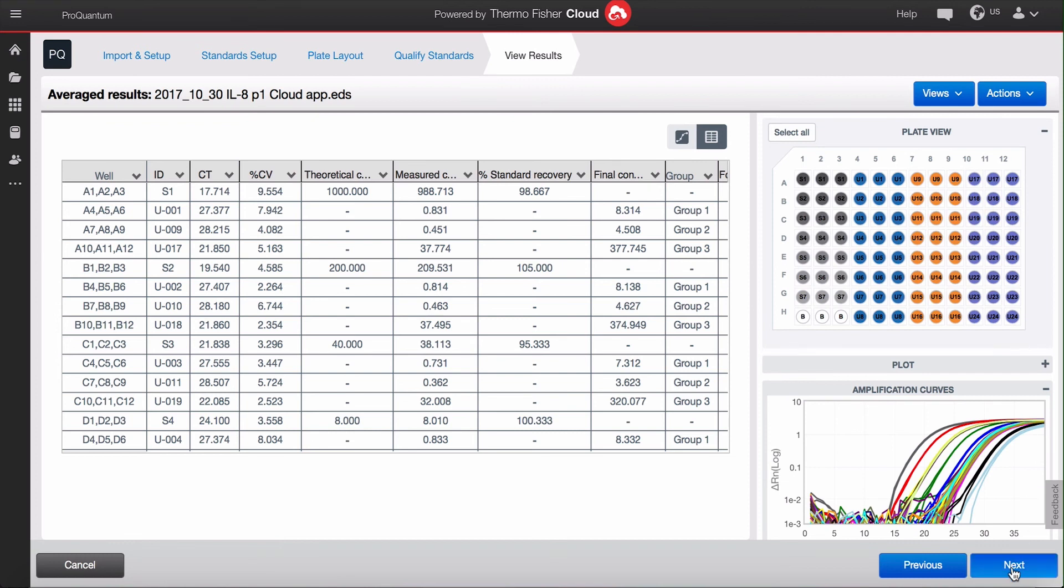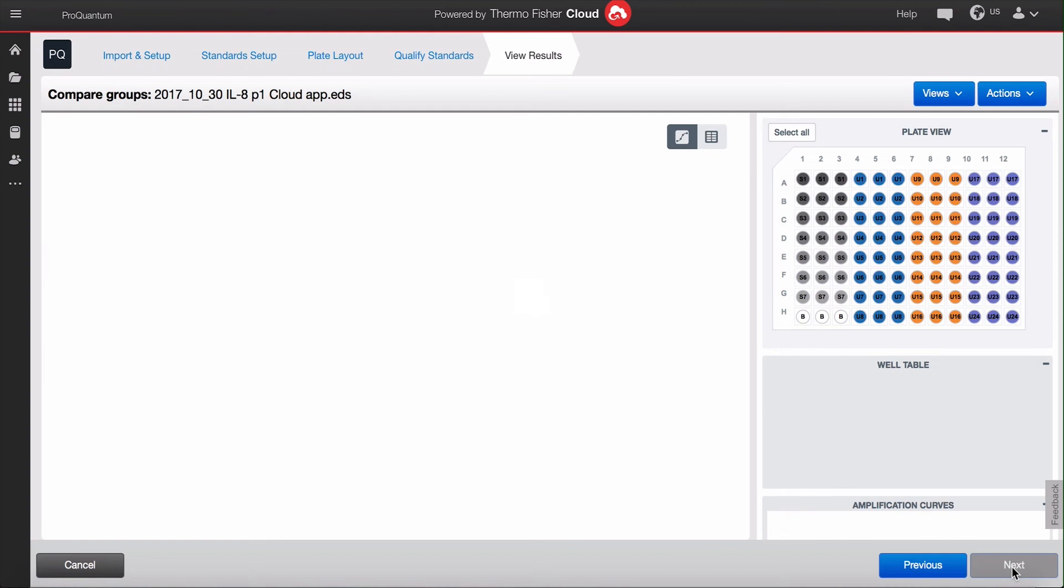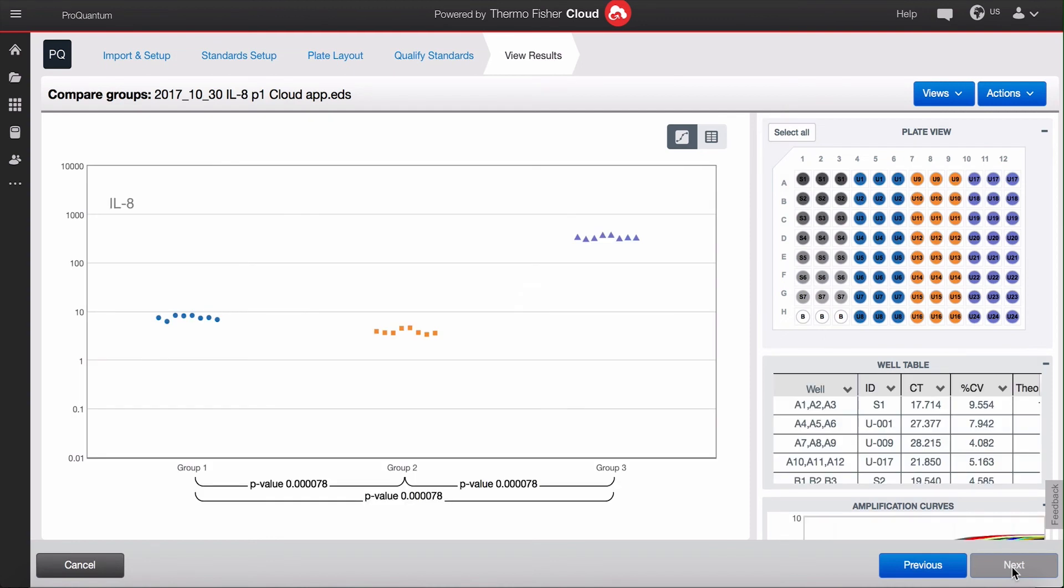If you have groups to compare, you can click next to view the statistical comparison. Go to the actions menu to export your data into Excel, PDF, or GraphPad Prism.